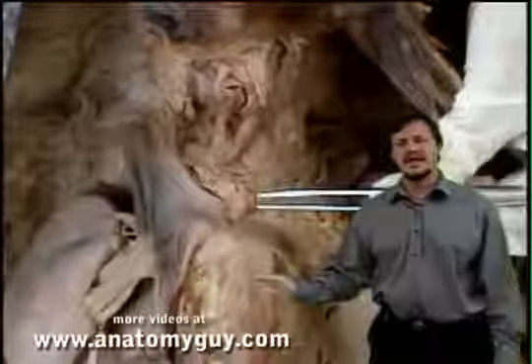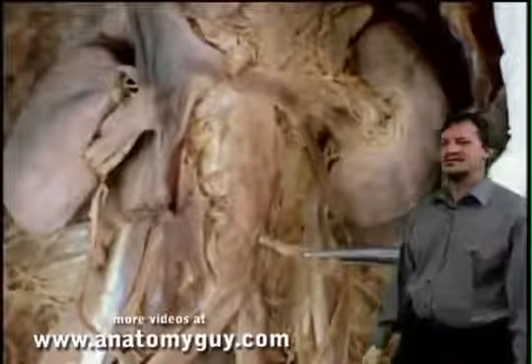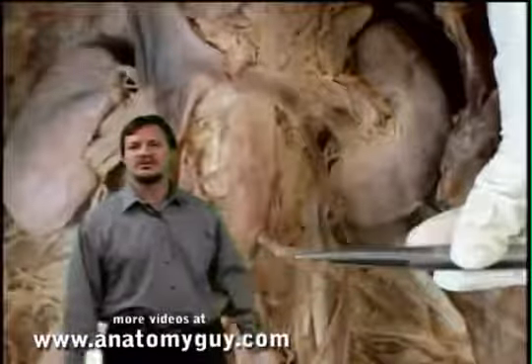If we pan down on this aorta now, we can see one of the gonadal vessels coming off, and then coming to the left, right here, that third unpaired branch, which is going to be the inferior mesenteric. The inferior mesenteric is coming over to feed the hindgut, which would include the descending sigmoid and the rectum.